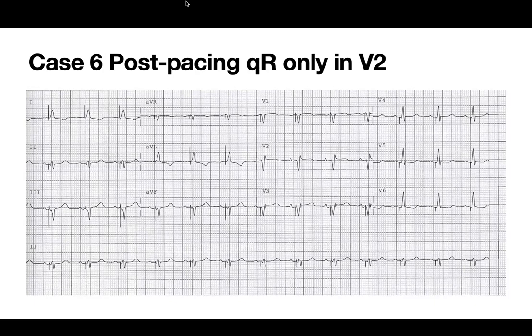Generally, I was going to mention at the beginning, we aim for mid-septum, but if you can't get mid-septum because of the anatomy of the patient or because of the sheath and stuff, the next spot is to go kind of lowish septum. That's what we're trying. So meaning in lead 3, we're trying to get negative, and then in 2, you're trying to get positive or biphasic, something like that most of the time. We work with the 6 lead when we're working. You go next.